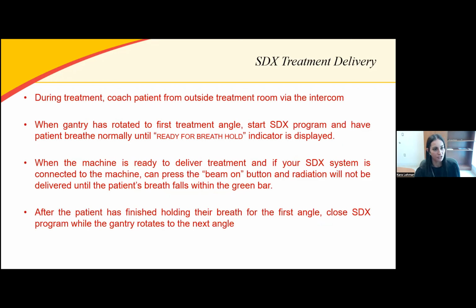And then moving on to SDX treatment delivery. This is the part where you'll step out of the treatment room and you'll want to communicate to the patient via the intercom. But just like before, you'll rotate your gantry to your first treatment angle. You'll start your SDX program and you'll have the patient breathe normally for a few cycles until ready for breath hold is displayed.